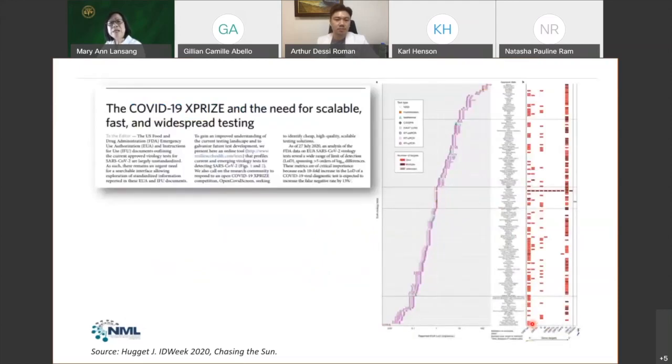And I'm just trying to show here the very big variability. The first prize goes to somebody who's able to reduce this kind of variability with a panel of RT-PCR samples shown to various labs here. And yet the different CT values range from this high, this low to this high. So be very careful about this kind of variability among the RT-PCR results.